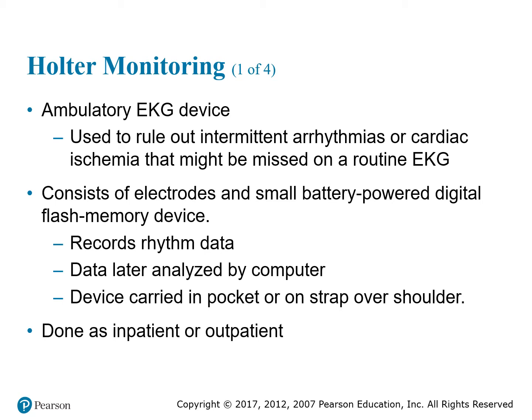So these are movable or portable EKGs that monitor a patient anywhere from 24 to 48 hours. They are considered an ambulatory EKG, which is another way of saying outpatient EKG.